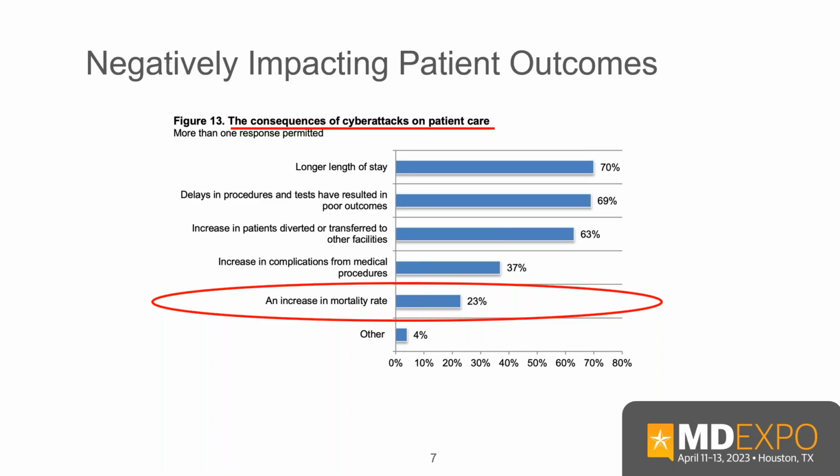But really, if you've got computer equipment and you're a nurse taking care of 16 people and the computer equipment goes away, you're not caring for those same 16 people the same way anymore. Right? I mean, quality of patient care is going down. Whether they die or not, different story. But the idea is this is critical infrastructure. When a CT scanner goes down, when cardiac equipment goes down, it affects people. You're diverting ambulances to other hospitals in the area. And so we have to do something about this problem.